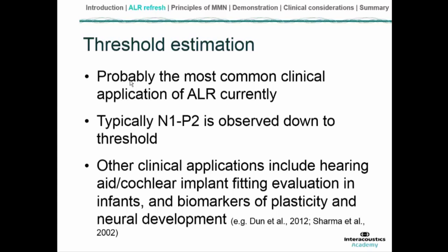Threshold estimation is probably the most common clinical application today. Simply, we turn the volume of the sound down progressively until the N1-P2 complex is no longer observed, and the lowest sound level at which it can be observed corresponds in some fashion to threshold.